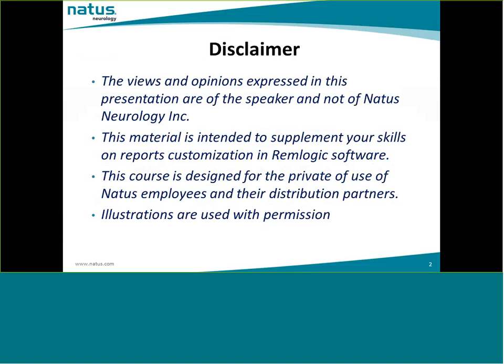So there's a disclaimer. The views and opinions expressed in this presentation are of the speaker and not of Natus Neurology, and the material is intended to supplement your skills on report customization in RemLogic software. And this course is designed for the private use of Natus employees and their distribution partners.